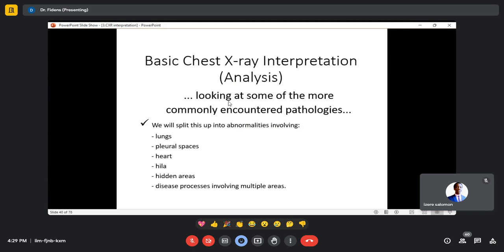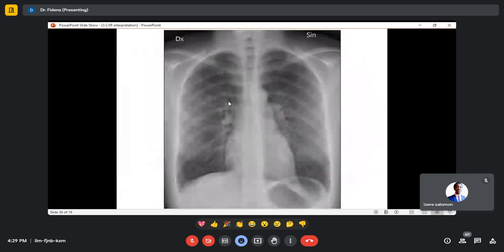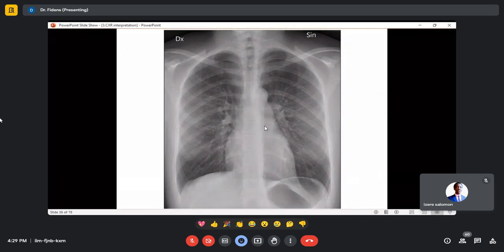So before I go to different diseases and how they look on X-ray, let me come back to this. Normally, not just me but others in different hospitals, we look at a chest radiograph through 4 parts.